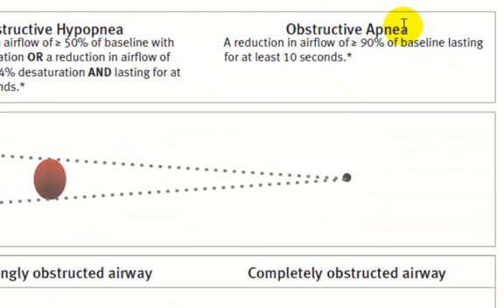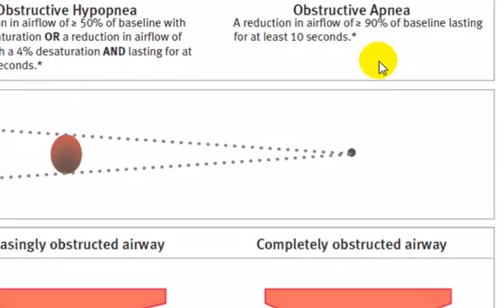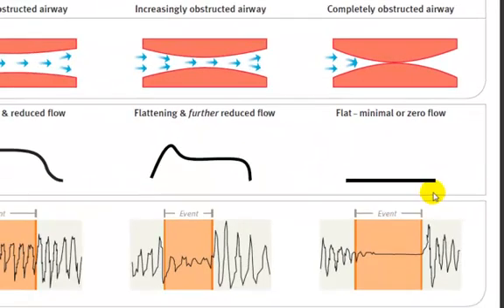Finally, obstructive apnea is a reduction in air flow of 90% or more of baseline, lasting at least 10 seconds. You can see a cessation of air flow in the airway channel, indicated as such.